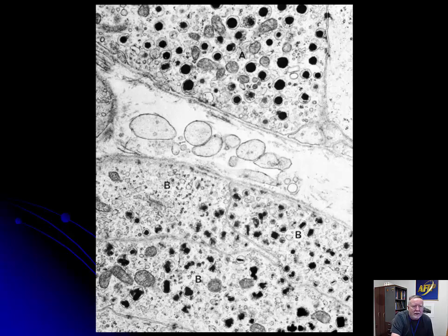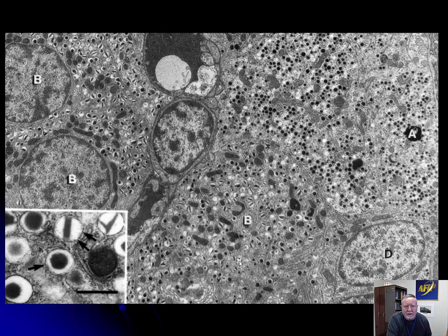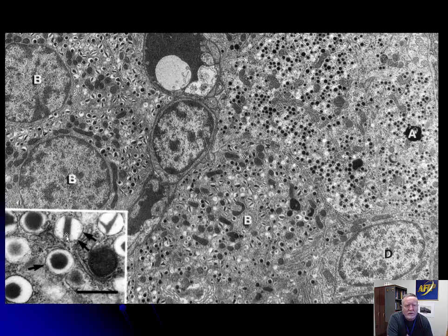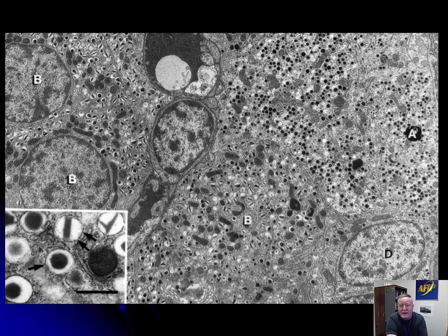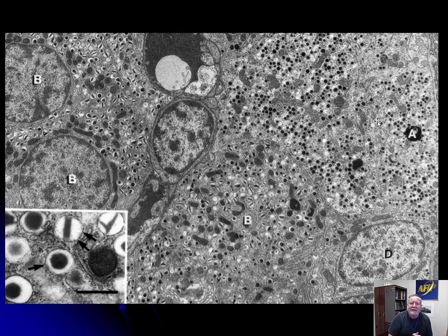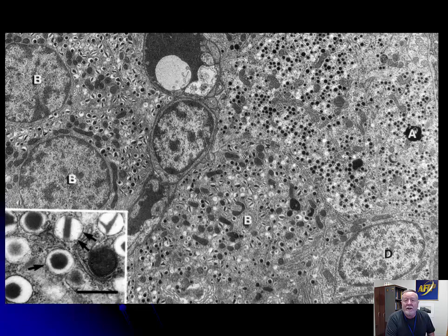The beta cells are interesting and a little different because their granules are somewhat varied — they often have linear or rod-shaped granules, sometimes looking like a little check mark. Nothing else really looks like that. The other cell types of the pancreatic islets, such as those secreting somatostatin or pancreatic polypeptide, will have your typical round granules. If you had an islet cell tumor and wanted to go old school by taking it to EM rather than running an insulin immunohistochemical marker, you would look for these little rod-shaped nucleoids within the granule.